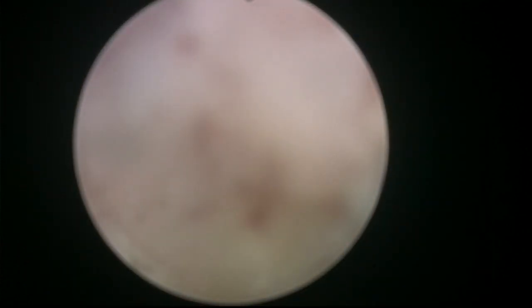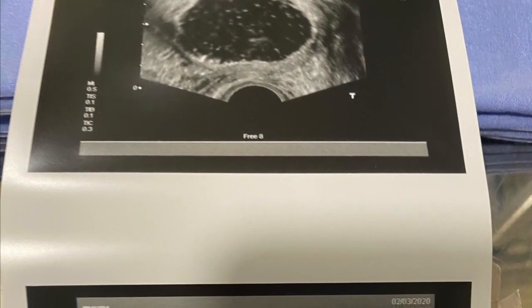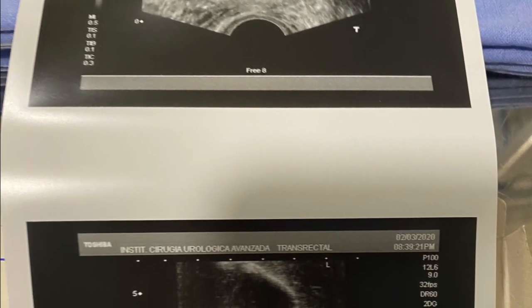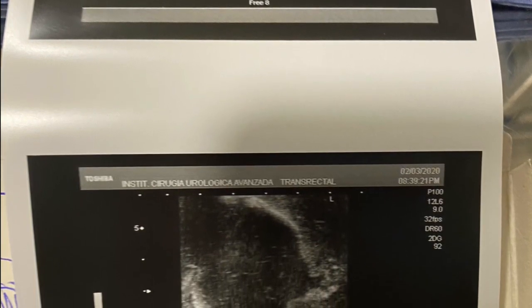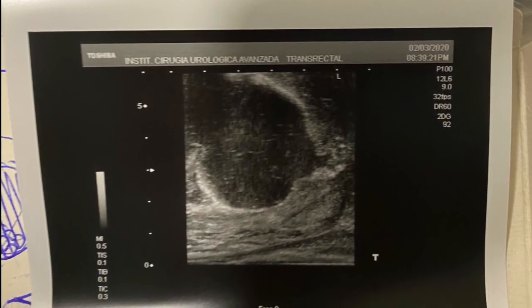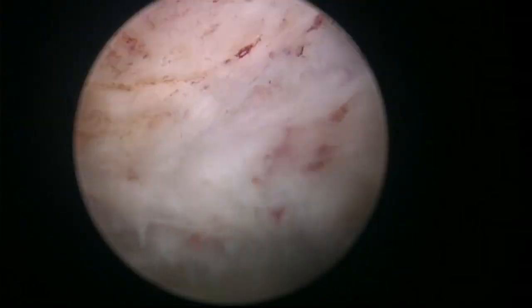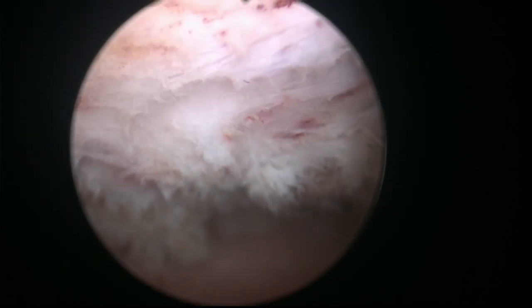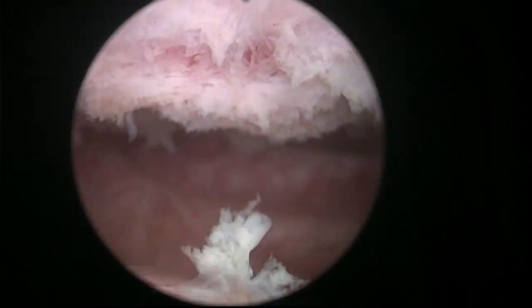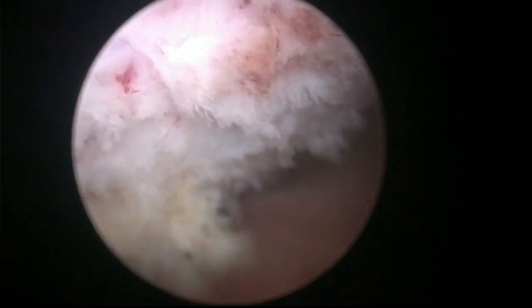There you go. Okay, so let's do the ultrasound. Okay, freeze first, and now print those. You're checking the transverse and AP, anterior posterior, longitudinal view of the ultrasound. It's very impressive, the wide cavity we have generated. Now we're going to take out the fiber, place the laser on standby. You can see the prostate or the adenoma filling the bladder almost, huh?